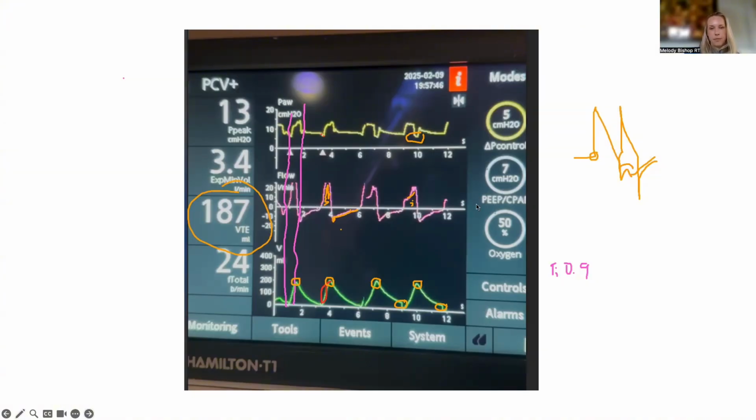If you took care of patients during the pandemic, reverse trigger was just rampant. There were a lot of times we recognized reverse trigger because of how much sedation the patient was on, the RASS is -5, you can't wake them up at all, they're maxed out on everything, but they're still double triggering. I actually have a great picture that I can pop in. A nurse was very upset one night because the patient was prone and they had ARDS, they had COVID, it was the whole deal.